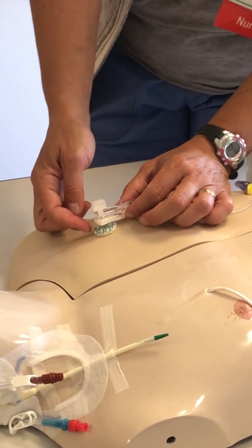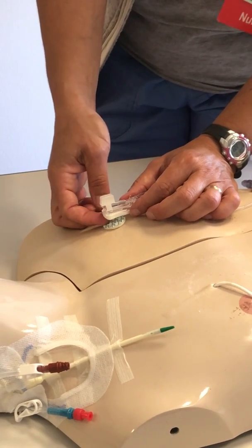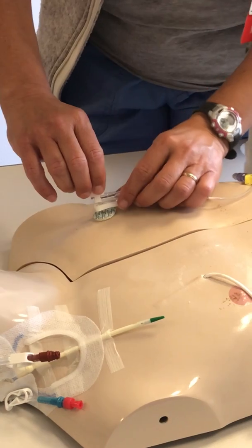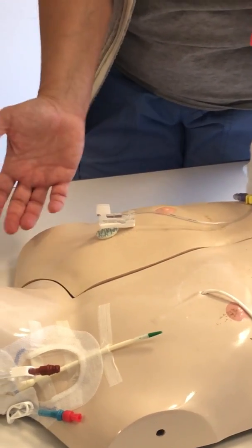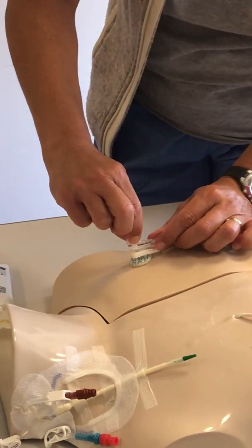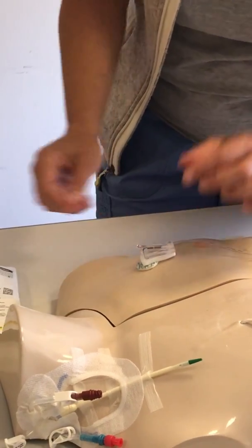And so what we can do is put another bio patch underneath this and build it up to keep it more stable. I don't have another bio patch right now, but you can put a couple bio patches. Don't put any gauze there because again, it'll have to be changed in 48 hours. What you'll do is you make sure you remove this plastic piece, and this has been used a lot so it kind of falls down.